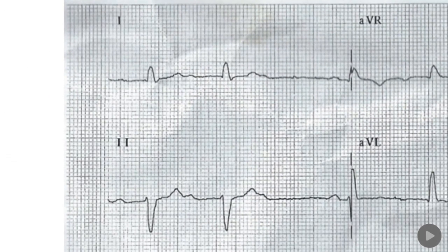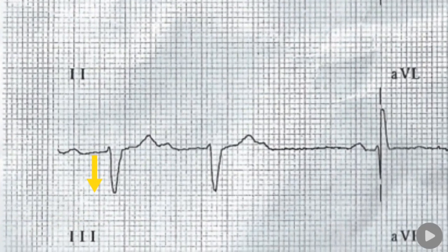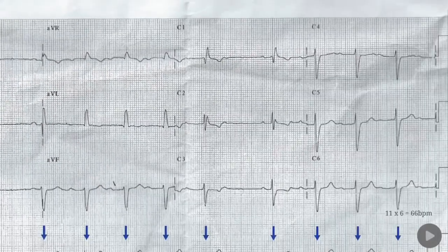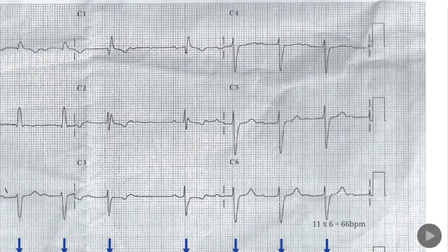The QRS complex in lead 1 is upright and downward in lead 2, which is showing left axis deviation. The P wave is normally conducted but the QRS complex interval is prolonged at 120 milliseconds in duration.